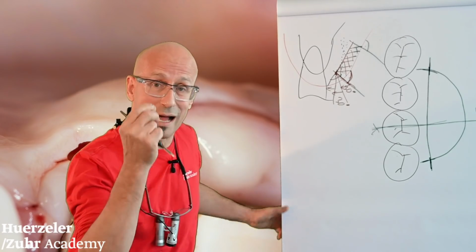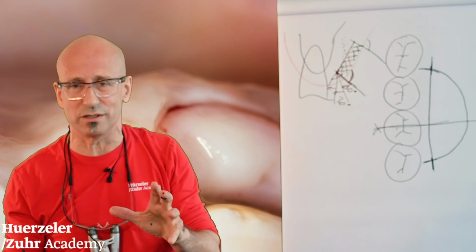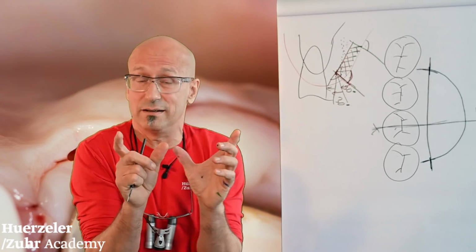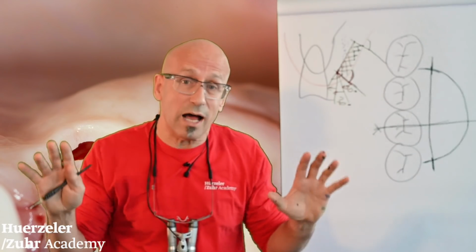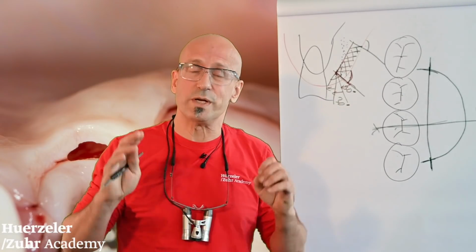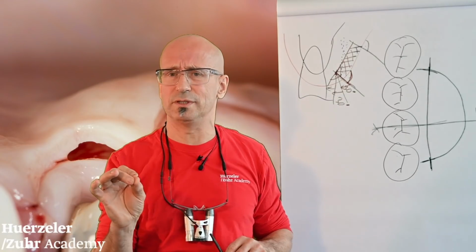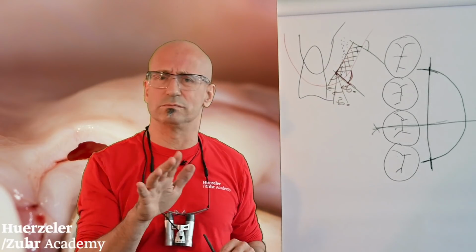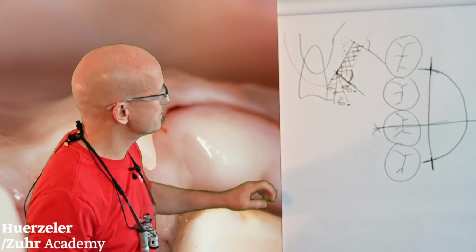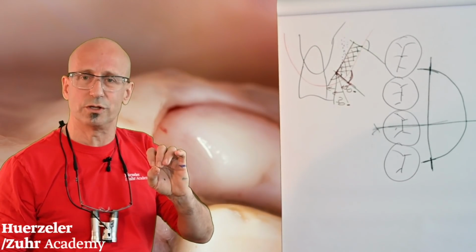At the moment, there are different goals depending on the indication. Sometimes you want the graft a little bit thinner, sometimes a little bit thicker. This depends on the clinical situation. But now for the exercise, we say, okay, split thickness flap, we would like to have a 1.4 millimeter thick flap. This would be great. This is our goal. That means we want to harvest now a graft with a thickness of 1.4 millimeter.